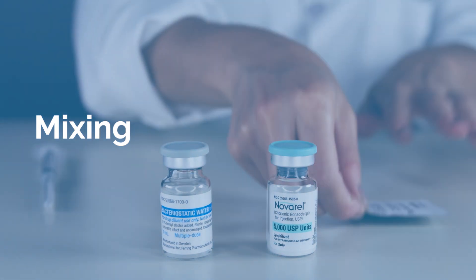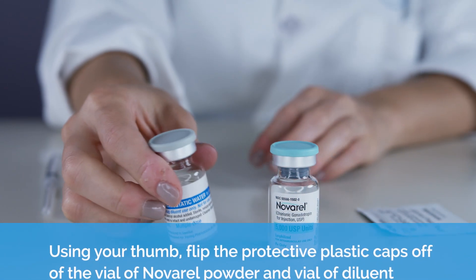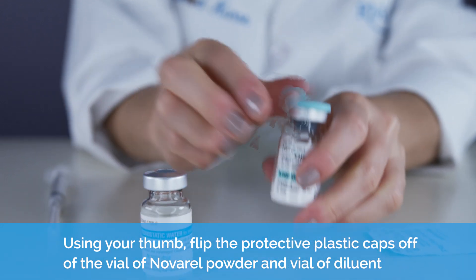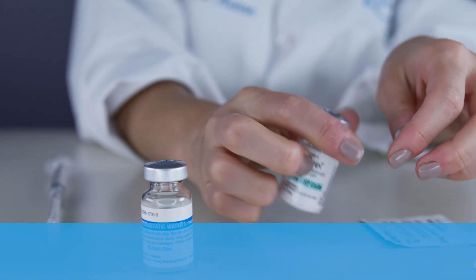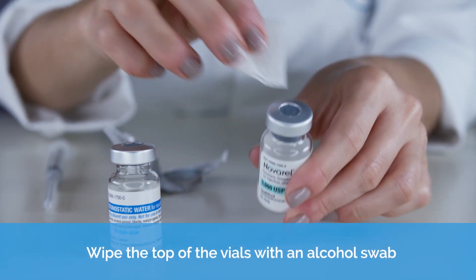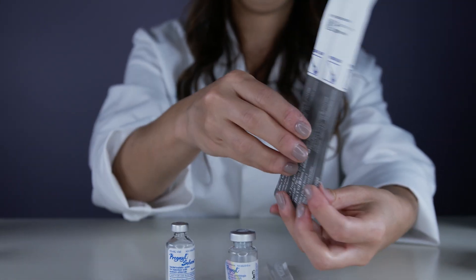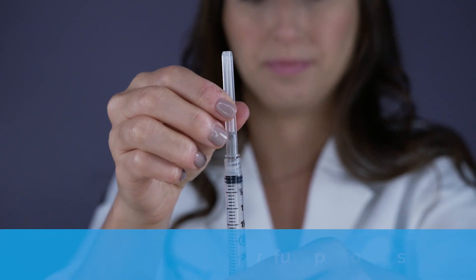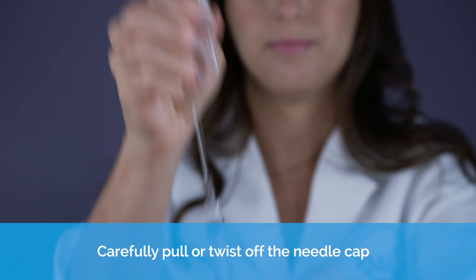Mixing. Using your thumb, flip the protective plastic caps off of the vial of Novorel powder and vial of liquid. Wipe the top of the vials with an alcohol swab.